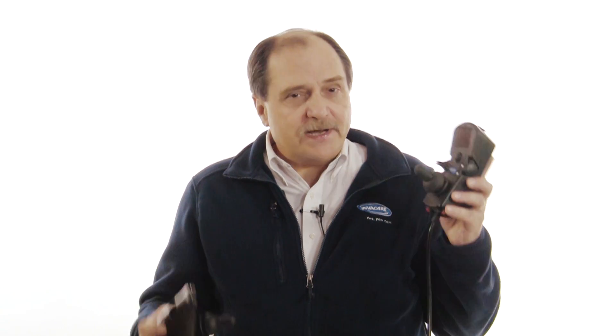A basic or non-expandable joystick can only operate in a momentary mode, whereas a rehab or expandable joystick can operate either in a momentary mode or a latched mode.